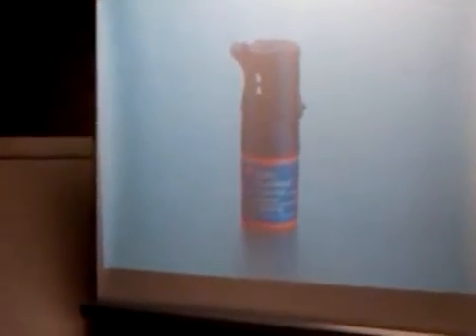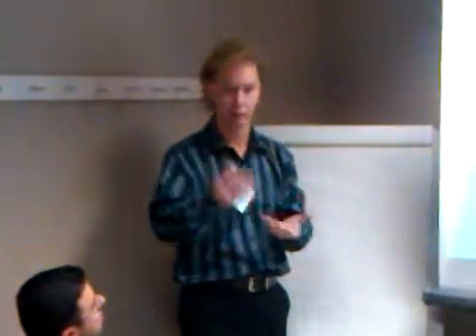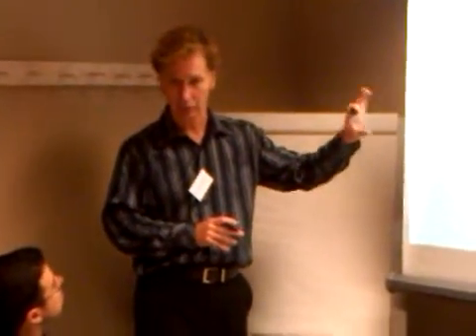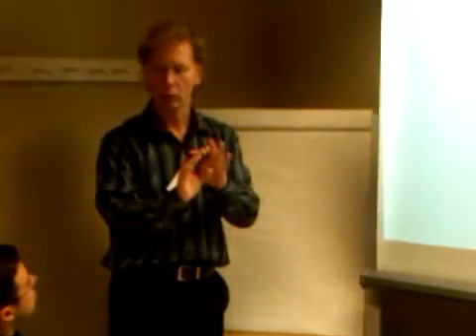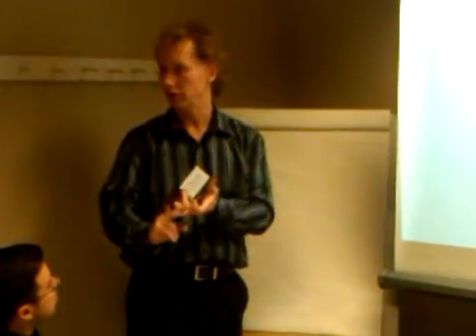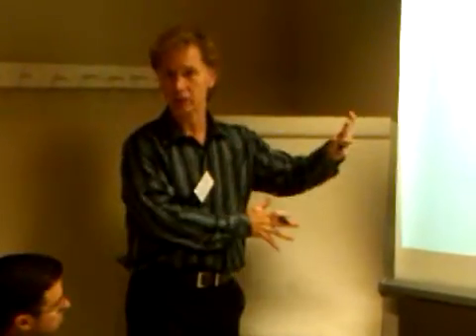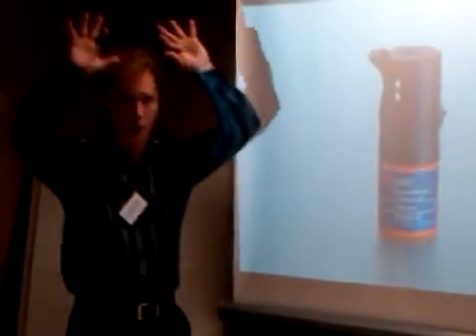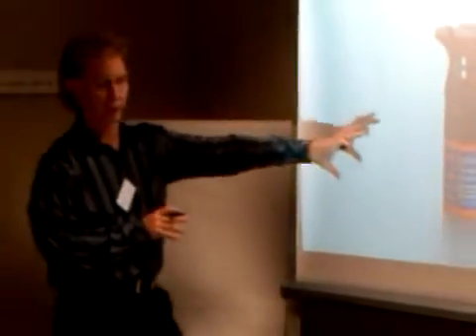All of the dentin bonding agents before had uneven coating of the dentin. So we had to air thin and cure up to 7 coats they recommended in the old days. If you look at the literature, that's too much. Under the microscope, if I agitate for a full 20 seconds over the dentin, I get the most beautiful even coats, even on secondary dentin, amalgam tattoo dentin, tertiary dentin, all this ugly, weird dentin. Before, it was uneven, so I had to do at least 2 or 3 coats. If you agitate for 20 seconds and air thin, your sensitivity will go to almost nothing if you quit exposing the pulp. We already talked about pulp capping. So that's number one thing I love about this.